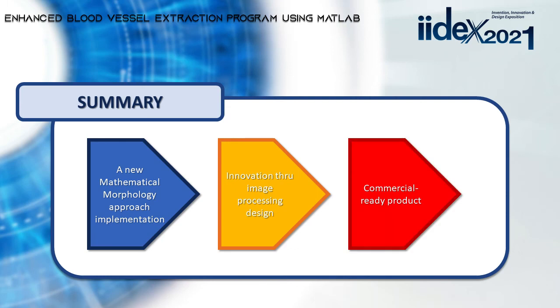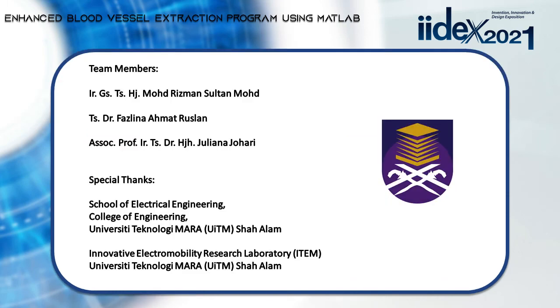This project is a commercial-ready product as it can be used straight away by the ophthalmologist and can be incorporated with the ophthalmoscope. With that, I end my presentation.